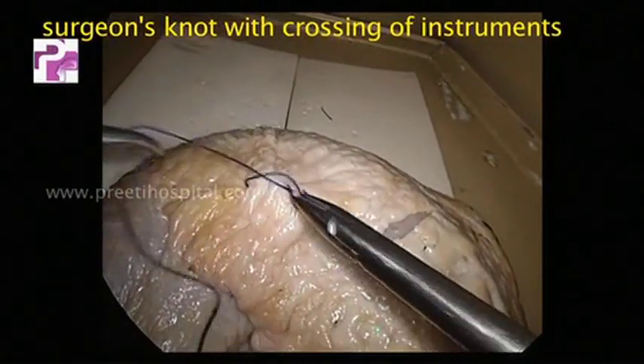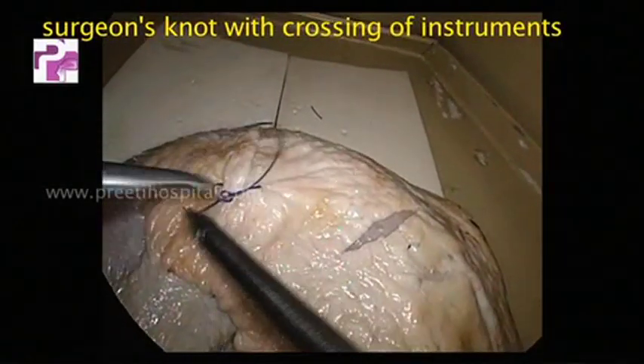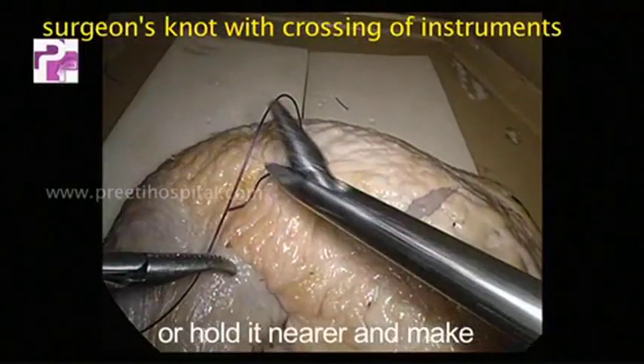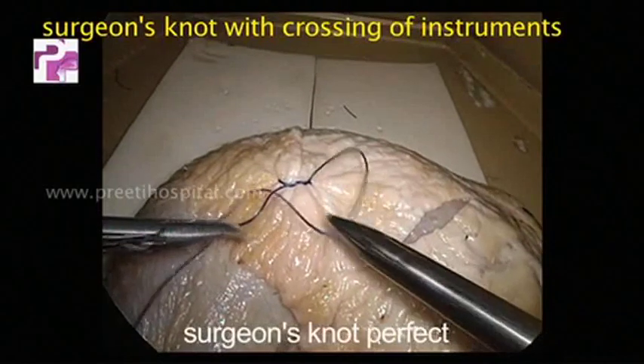Hold the tip of the needle. Now you have to cross to avoid the reef knot. Leave the thread or hold it nearer and make the surgeon's knot perfect.